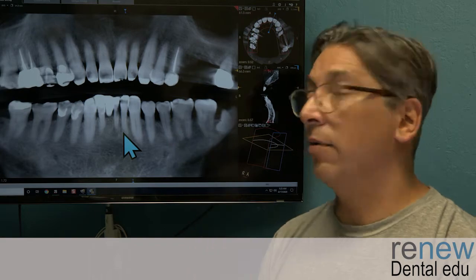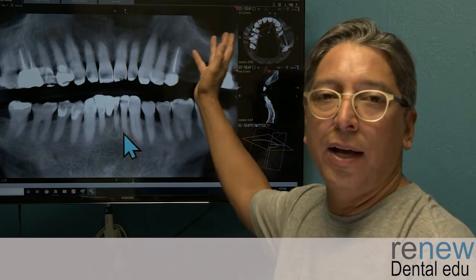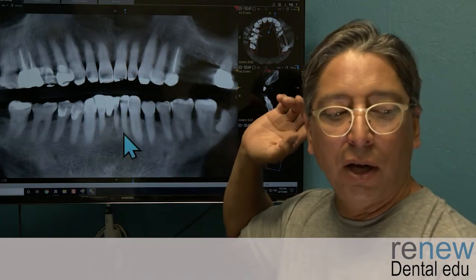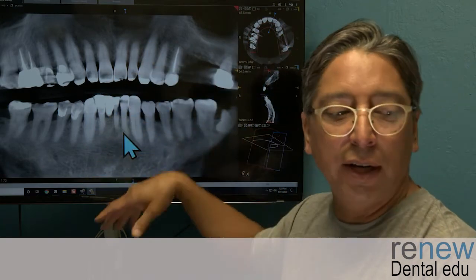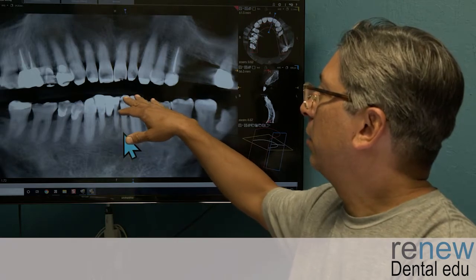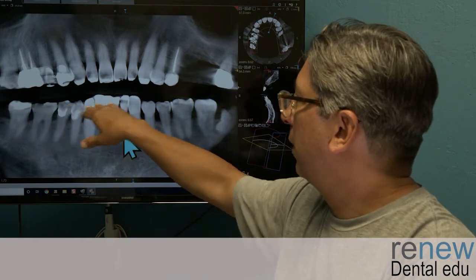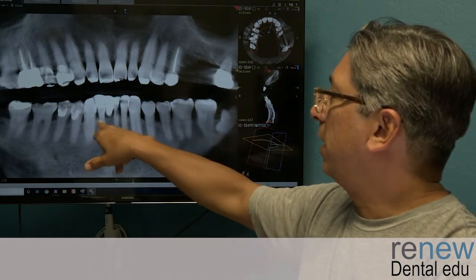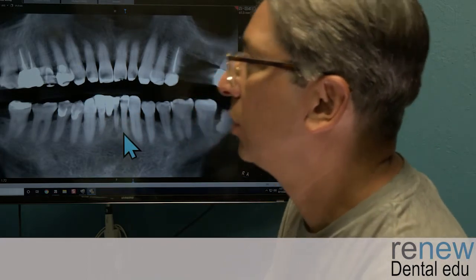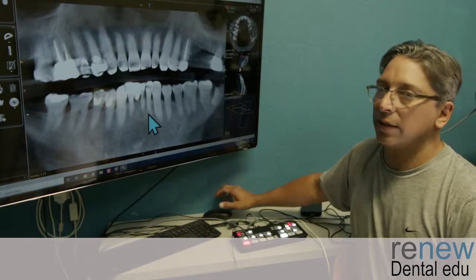So I'm still going to evaluate that upper left side for you. We have a light green area. We have to yellow. We have some constriction issues when you look at the whole mouth. We have really good density, so we have a green there. And the only orange I would kind of give him is looking at some of the failing teeth. He does have chips here, and then he has this kind of uneven pattern of his bite a little bit, but he also has this bridge, which means that there was a failed front tooth there. So I'd probably give him an orange just because I don't know enough about how he's biting across his front teeth. So let's look at this case here.